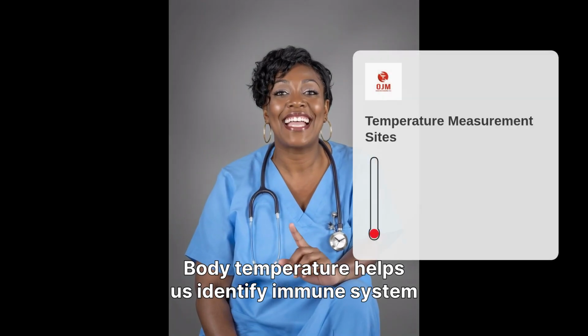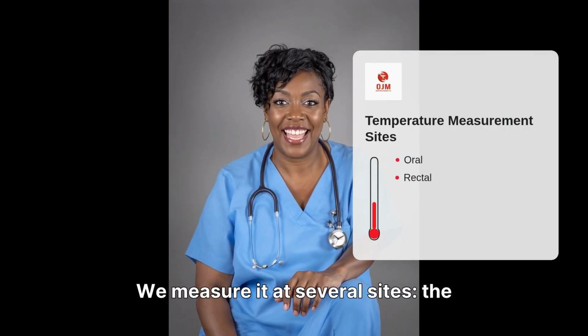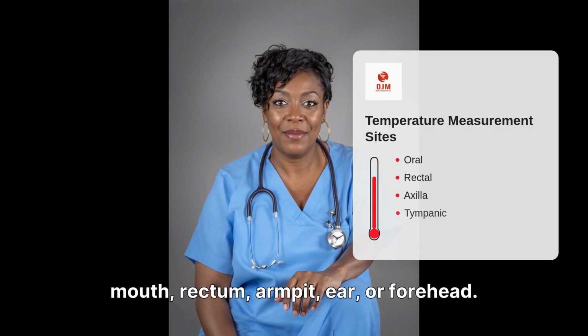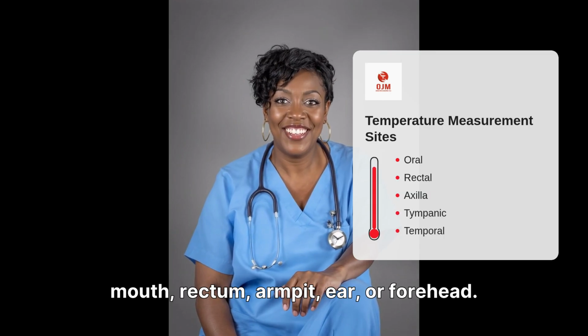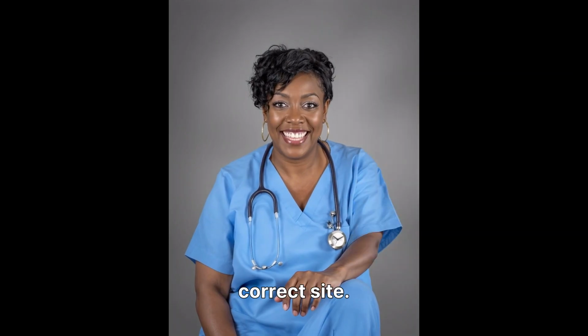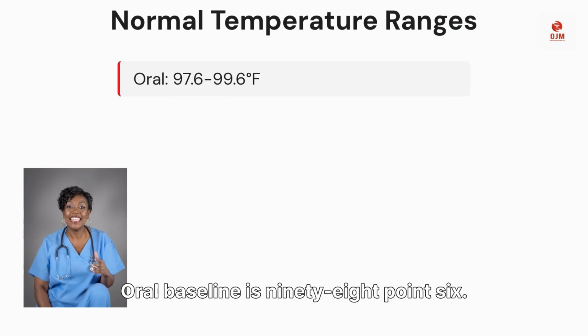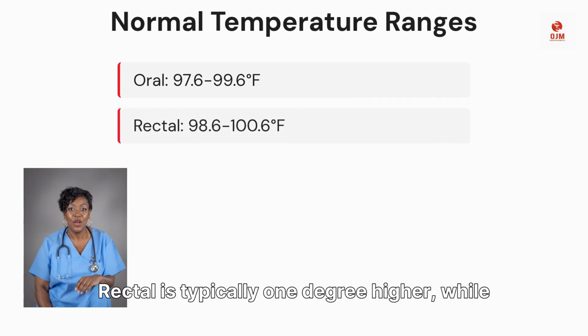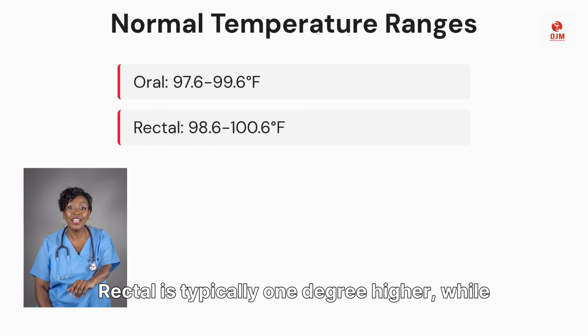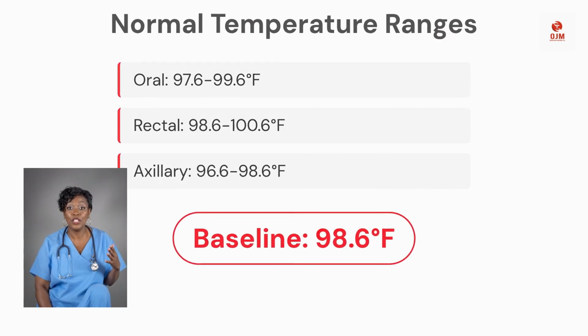Body temperature helps us identify immune system issues. We measure it at several sites: the mouth, rectum, armpit, ear, or forehead. Always check the care plan for the correct site. Normal values vary by site. Oral baseline is 98.6. Rectal is typically 1 degree higher, while axillary readings are usually 1 degree lower than oral.